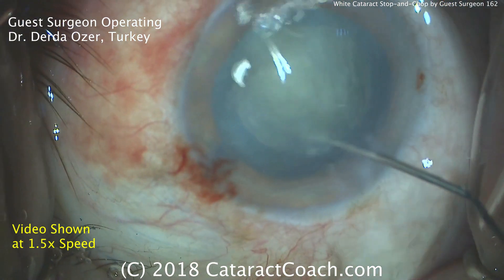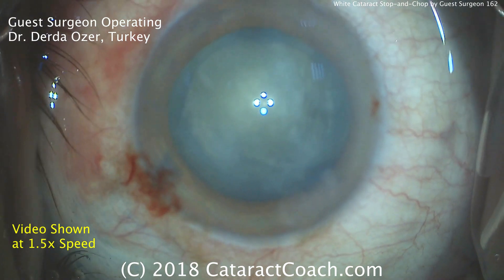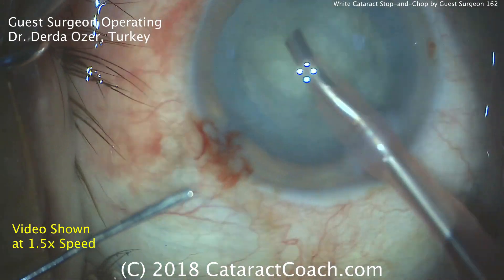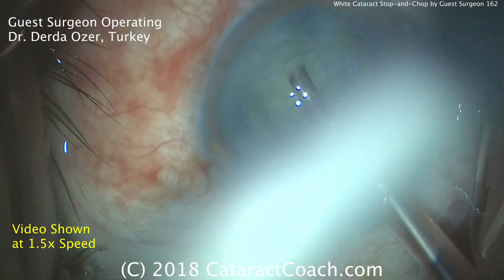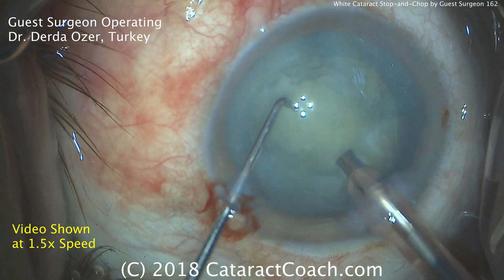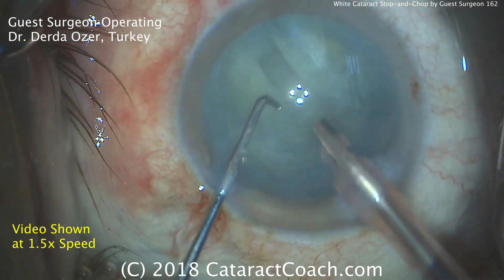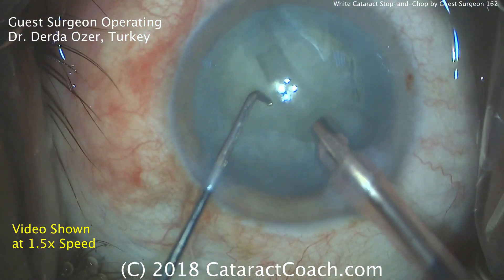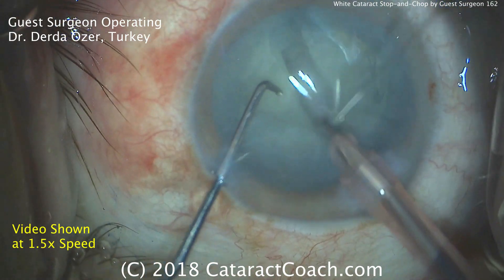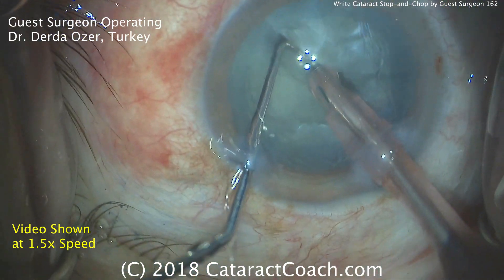The surgeon is going to use a stop-and-chop technique. Here's the phaco probe in the right hand; the left hand is holding the second instrument. Cleaning up the anterior cortex, and now here comes the first groove. It can be a little tough to judge the appropriate depth of the groove, but Dr. Ozer does a very good job with that — grooving down and checking depth. You can often tell compared to how big the phaco probe is. There's a nice split — a beautiful split. We have two halves of the nucleus.